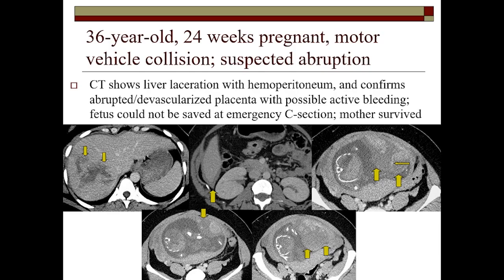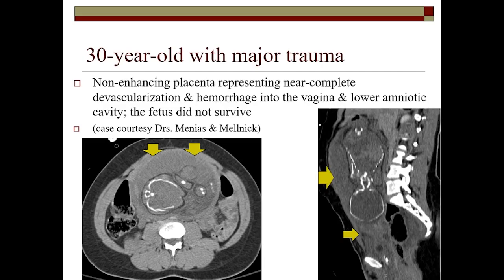Here is a case from my institution of a 24-week pregnant woman who had significant injury. You can see the complex liver laceration and hemoperitoneum. On the upper right you can see a cleft in the placenta — this placenta is abrupted and disrupted, with active hemorrhage as demonstrated by that small arrow, and bulging posteriorly from adjacent hemorrhage. Unfortunately, this fetus did not survive. The CT was done for staging of the mother's organs, and the obstetrical team knew the fetus was at risk and that there was an abruption, but unfortunately the baby didn't survive.